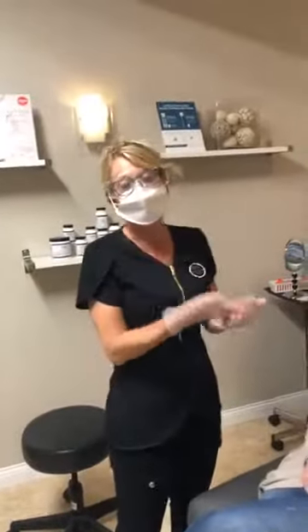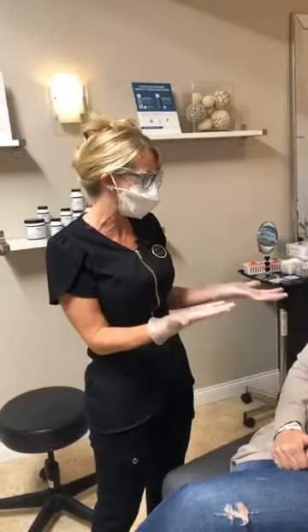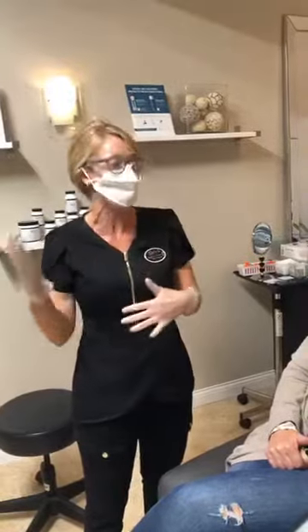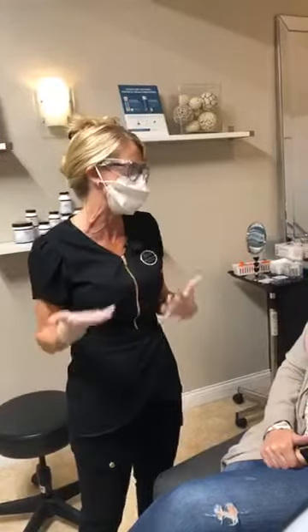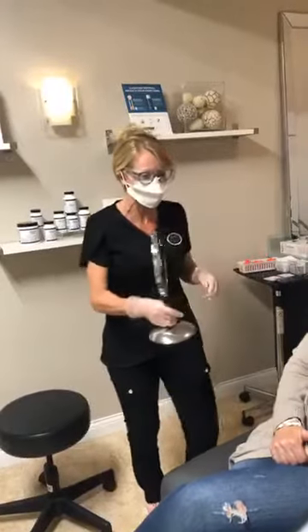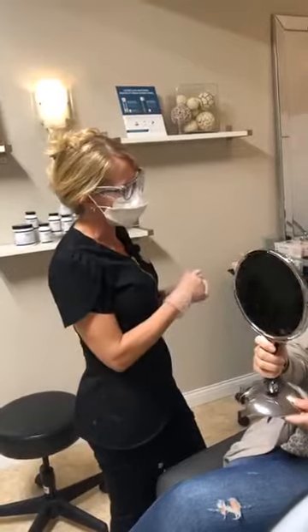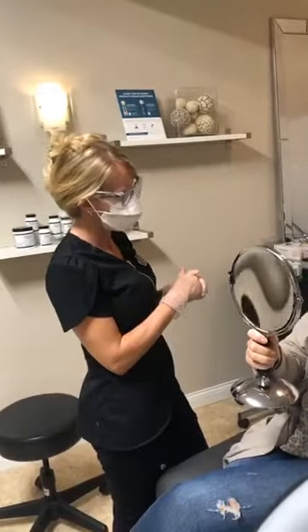But obviously, as with everybody, we don't want to put a whole bunch of filler in. And so doing a little at a time is actually a great way to do filler. So before we get started, Linda, I'm going to hand you the mirror. And what bothers you? My jowls bother me, and I just feel like people think I'm sad. Everything's kind of droopy.